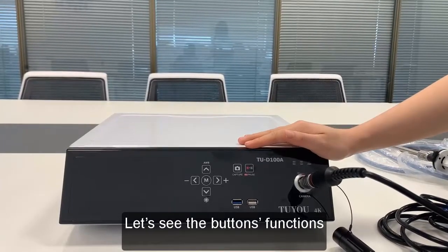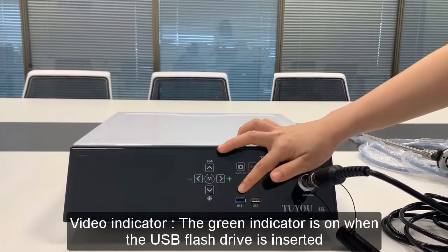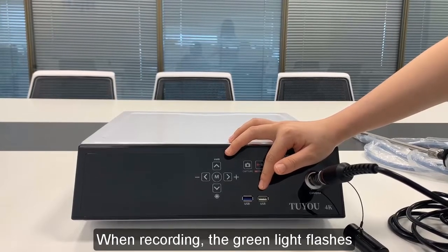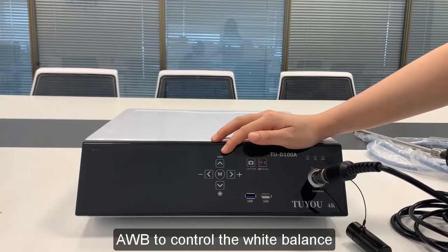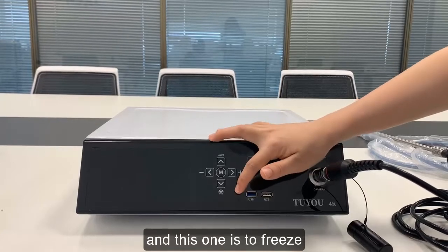Let's see the button functions. Video indicator: the green indicator is on when the USB flash drive is inserted. When recording, the green lights flash. The direction button can control the brightness and digital zoom in and out. AWB controls the white balance. This button controls the freeze.